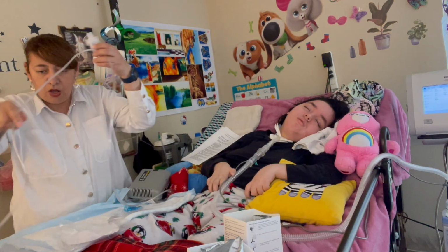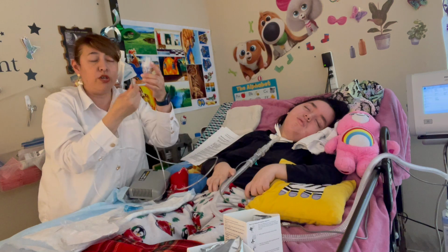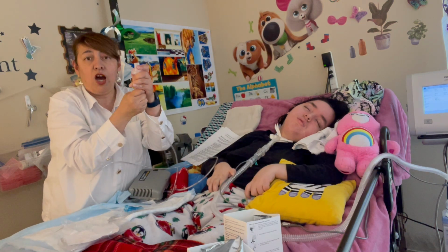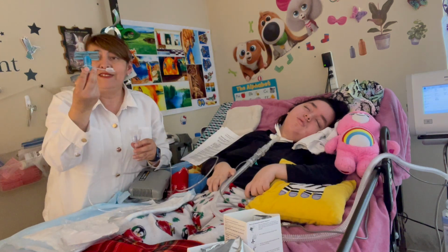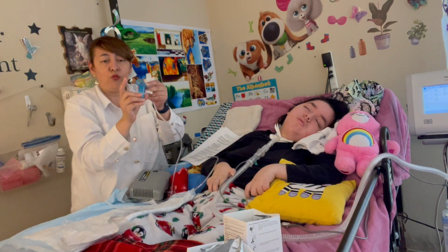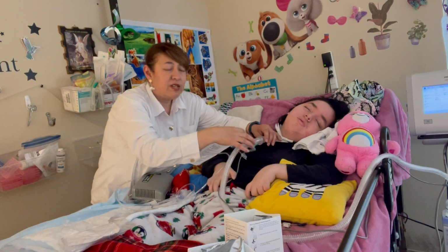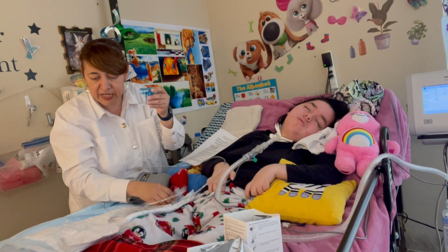This is the long tubing that is connected to the machine, and you're going to connect it here into the cup like this. And this is the T. It is called the T because the wider part is going to be connected to this part. Let me show you. I just have to show you first the names of each item.